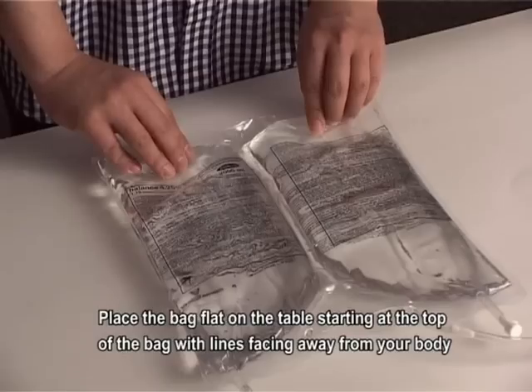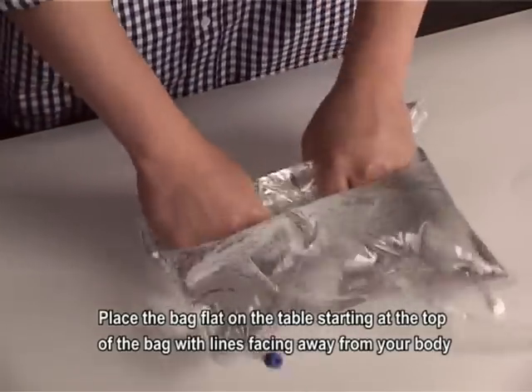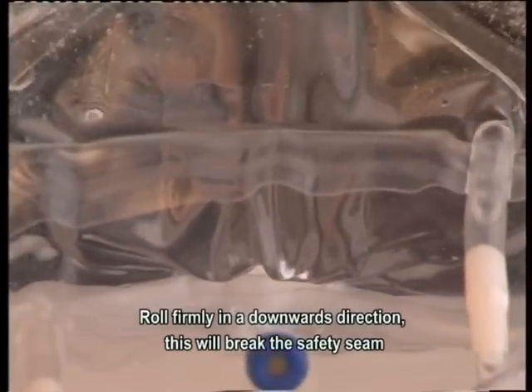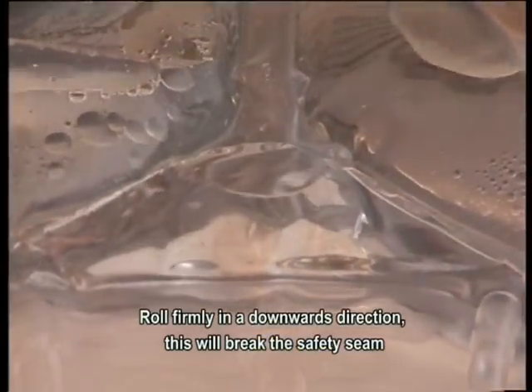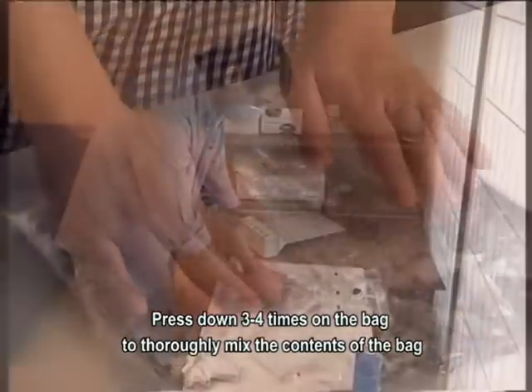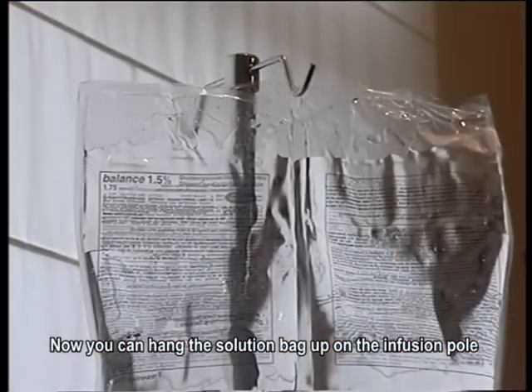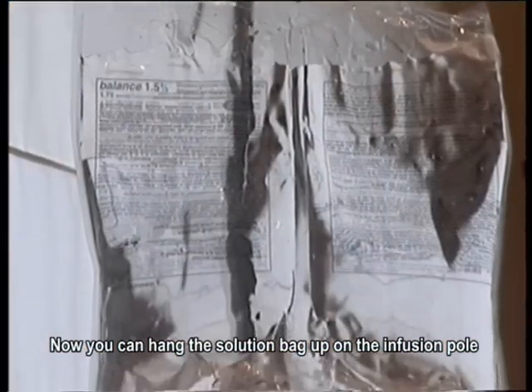Place the bag flat on the table. Starting at the top of the bag with lines facing away from your body, roll firmly in a downwards direction. This will break the safety seam. Press down 3 to 4 times on the bag to thoroughly mix the contents of the bag before continuing your exchange. Now you can hang the solution bag up on the infusion pole.